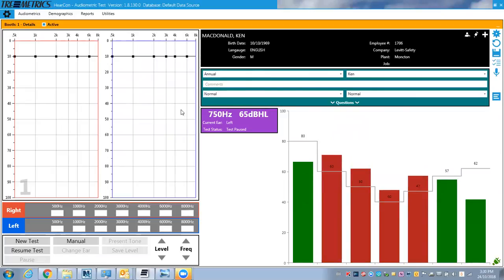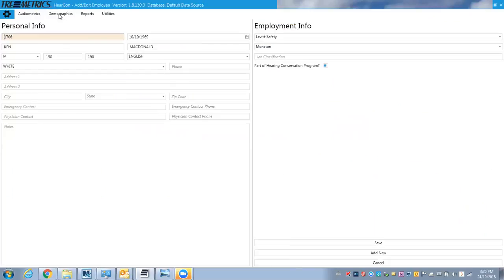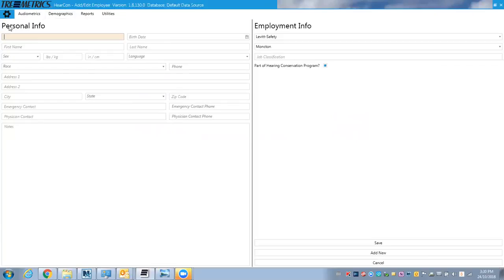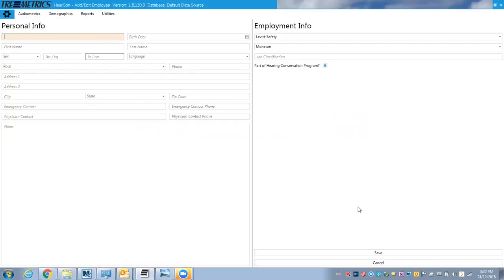So if we want to add people that are going to be tested, we can go to demographics and we can add people or we can find people that are in the database already. If I click add, then I would enter in their identification number, birth date, all that information and hit save and they'd be added to the database.